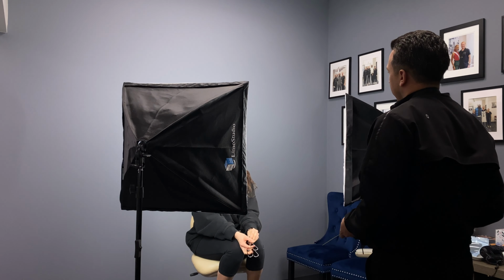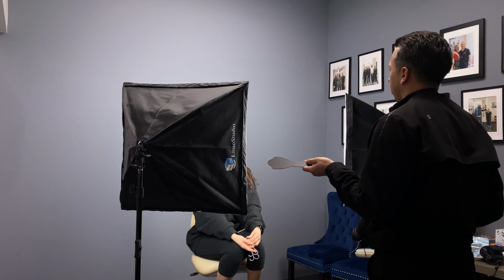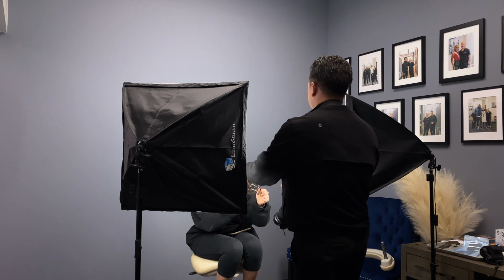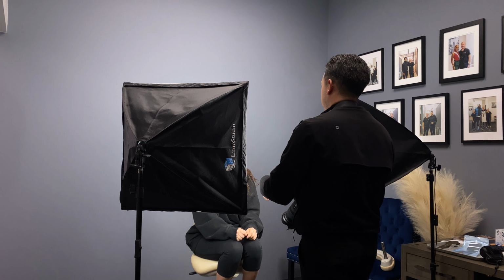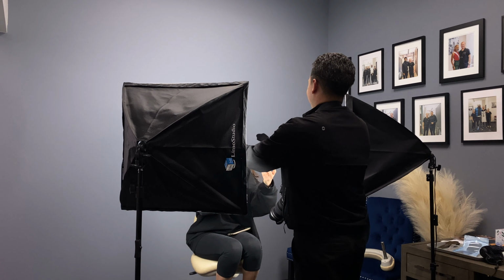Now, I went through the sequence really quick. I just took a straight on shot, had her turn her head to the left 45 degrees, to the right 45 degrees, and I specifically said turn your head 45 degrees to the left. For some reason, people know how to do that.